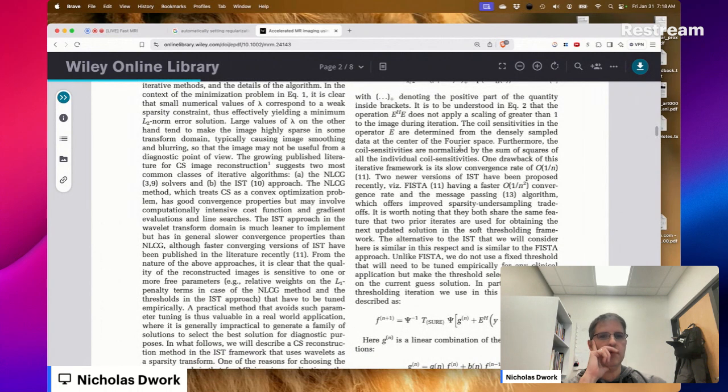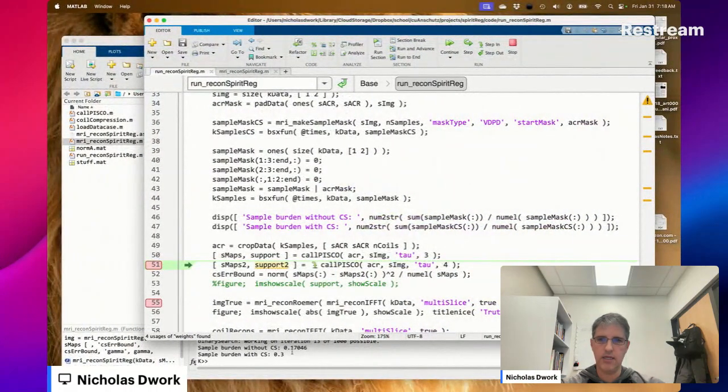Some coil sensitivities are normalized by the sum of squares of all the individual coil sensitivities. Do they mean all the individual elements of the coil sensitivities?